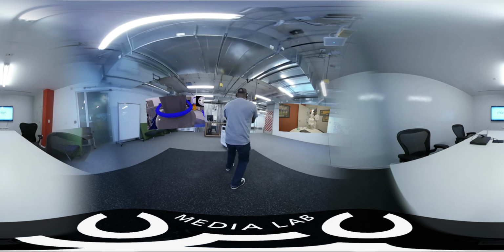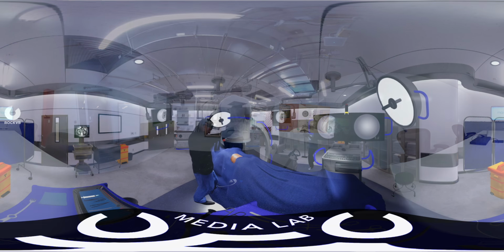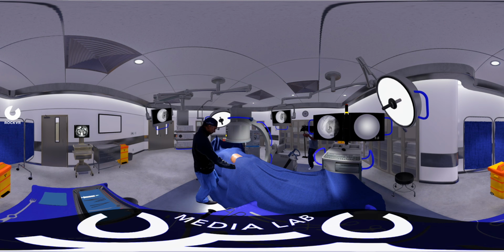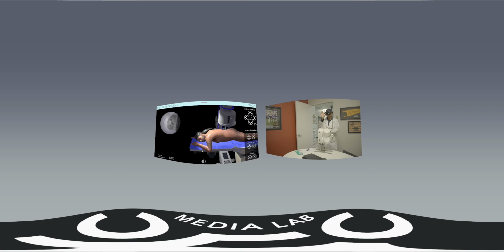the kidney's moving with me, right? You can see the shape of the kidney. There's this dye that fills up the kidney. If I take this C-arm, activate it, and pull it towards me, we call that obliquing the image. If I oblique the image, I get a sense of how I want to line up that image and my needle that's in my hand here.